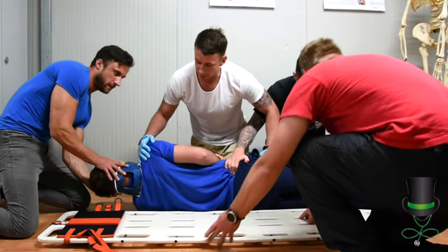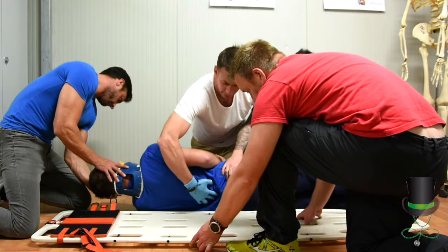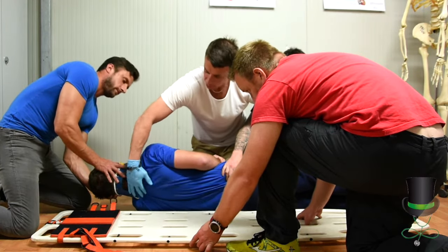When the patient is up, you may now check for any injuries on his back. Feel along the spine and check your gloves for any blood.